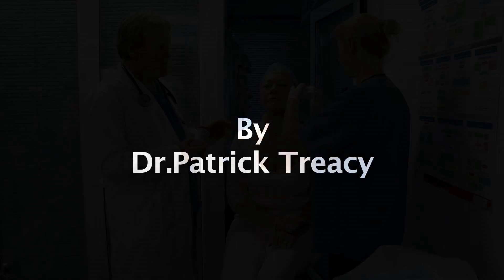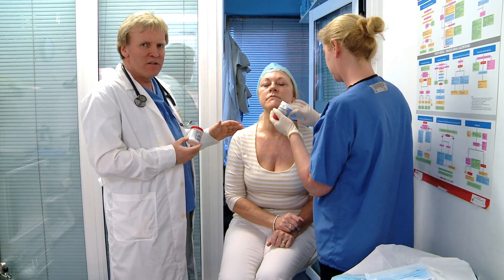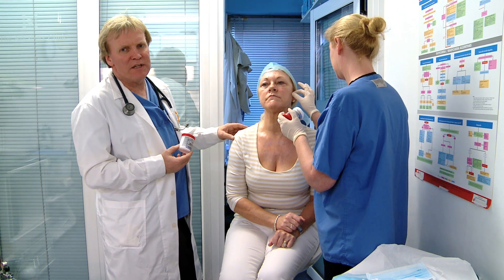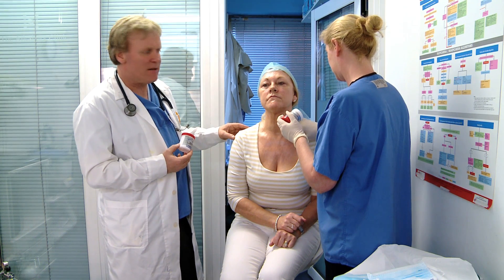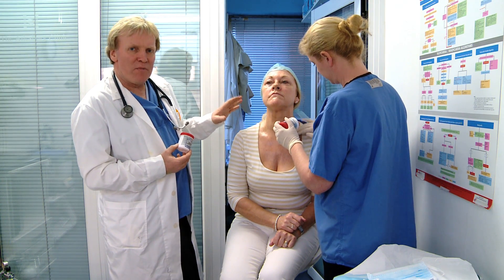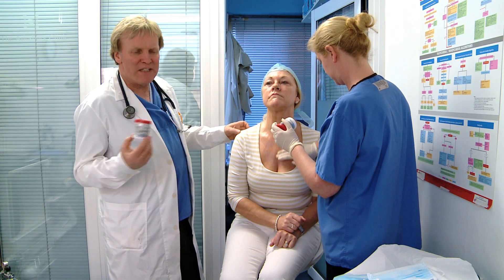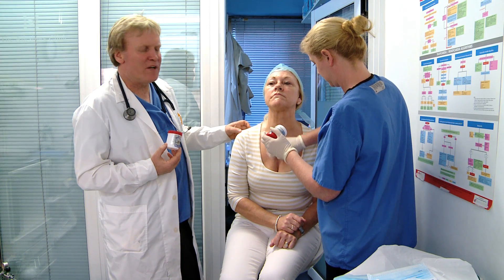As part of the anesthetic preparation for Active FX, we find that it's not really necessary to give IV sedation. We used to tend to give a lot of intravenous midazolam, but if we use topical anesthetic in regional nerve blocks, the patient will get a very satisfactory level of pain control, especially since we tend to use much higher laser settings than conventional.